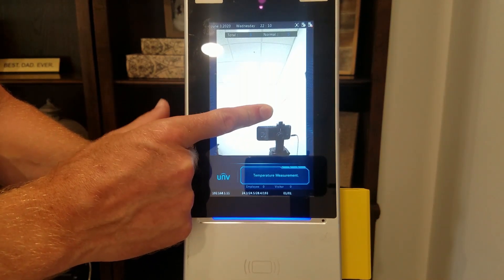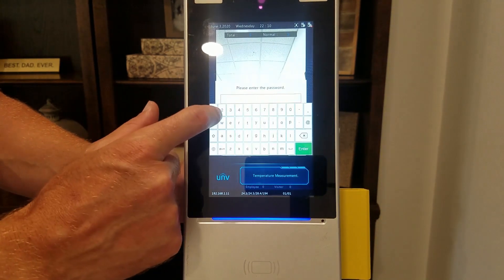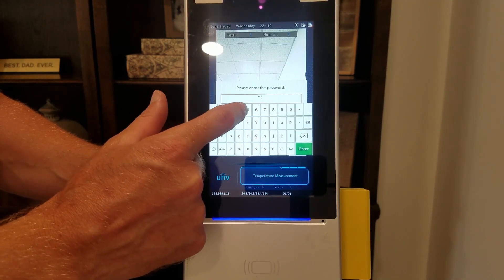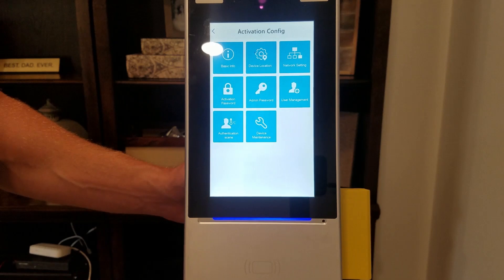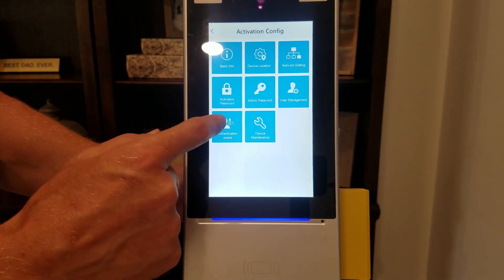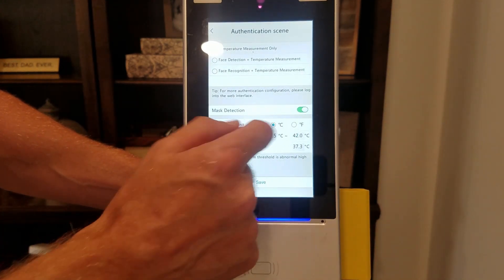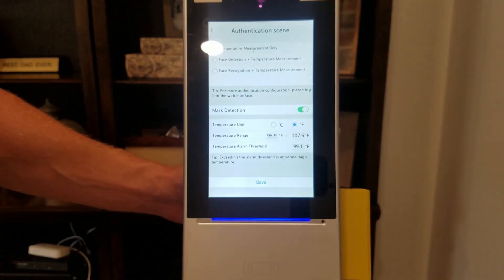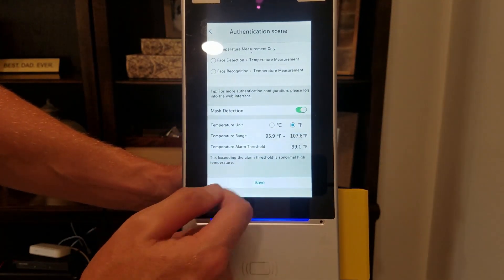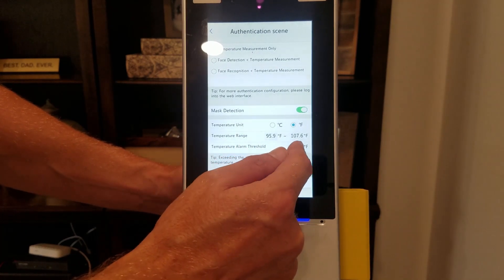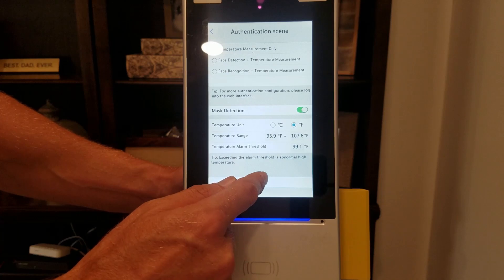To get into the menu, just hold your finger down on the screen for a bit and the password prompt will pop up. Enter your password, then go to Authentication Scene. Here is where you can change the temperature unit to Fahrenheit. You can also adjust the temperature range and the temperature alarm threshold higher or lower, then click save.